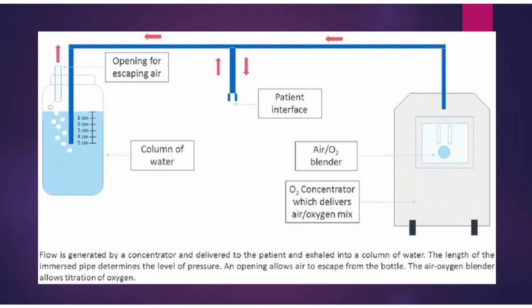She's just mentioned that the chart she showed is only valid if your concentrator is working at 95%. But for very many of us, our concentrators are not at 95%. They may be at 60 or even 50%. So you might not know how functional your concentrator is. But you can increase the oxygen flow and reduce the airflow according to the baby.